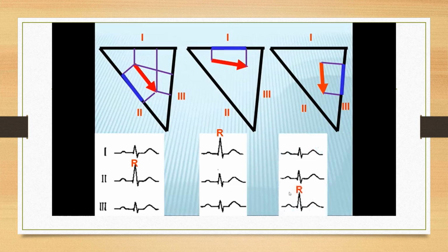But in case of vertical position, R3 will be greater and R2 more than R1. And we also have another condition, that R3 is bigger than R1 but not more than R2. It is also the condition for vertical position.